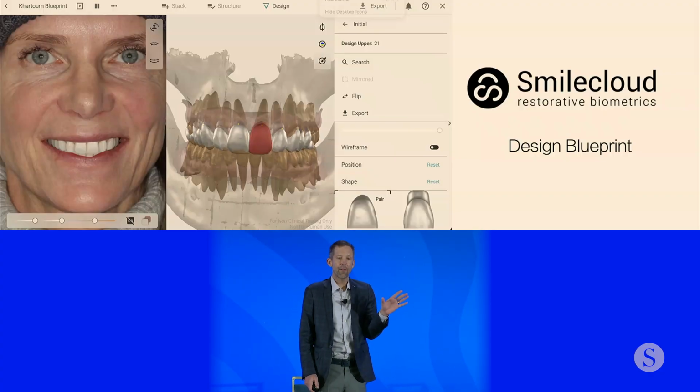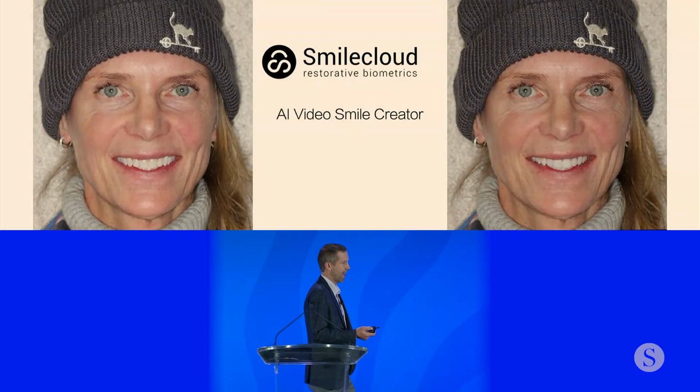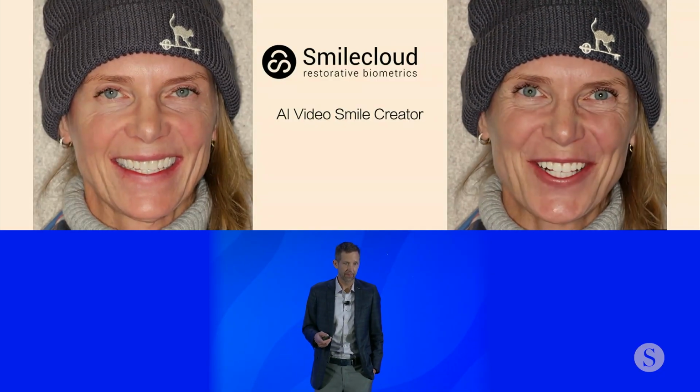But now that I have all this information, I can take it into the AI and come up with a plan. So when I present to the patient, I have the smile design on the left, and then I can animate the AI on the right to show her what is realistically possible with her smile.